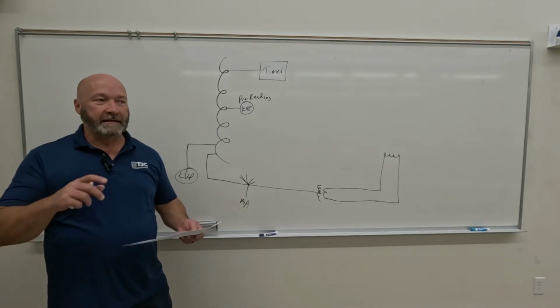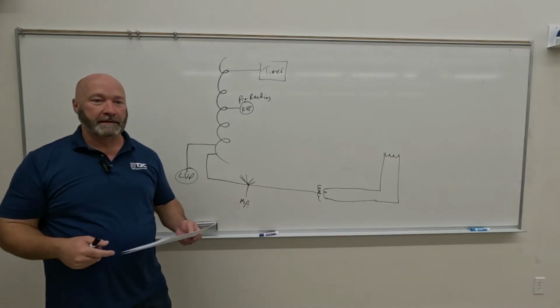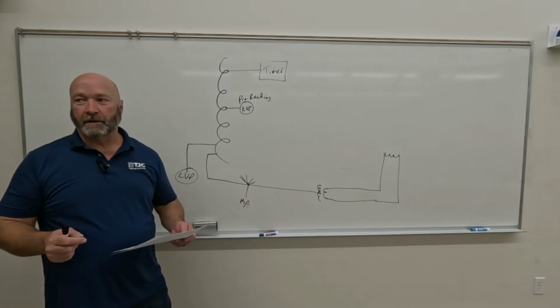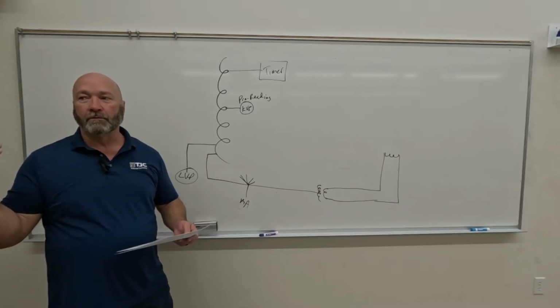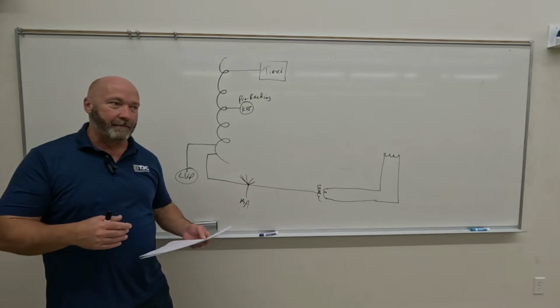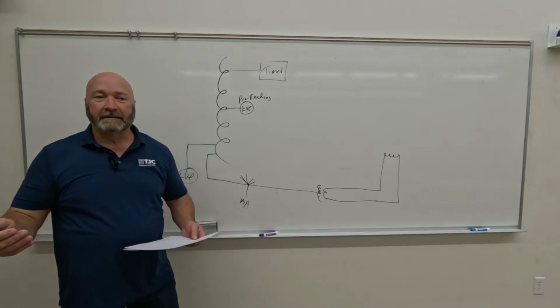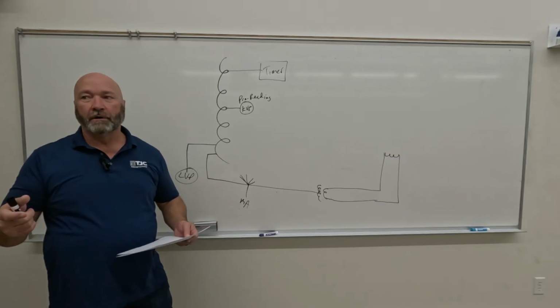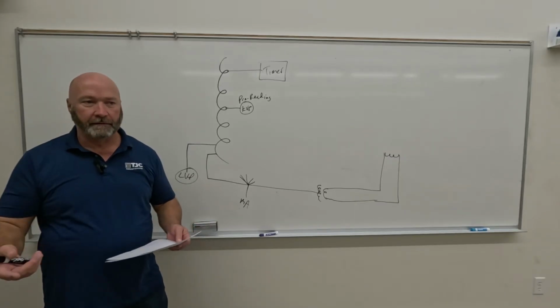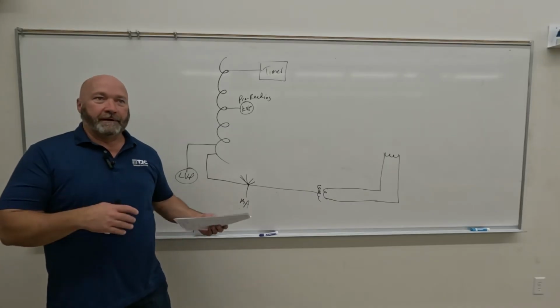So using AECs, how do you control your time? Or how do you operate time? Trick question? You don't. It's the only type of timer, and this is something I didn't point out on Wednesday, that requires no manual manipulation by you. Can you affect a change in time?